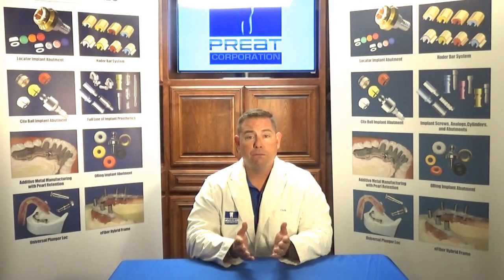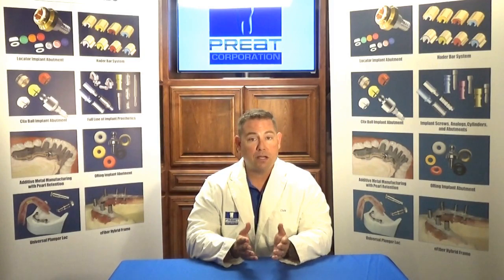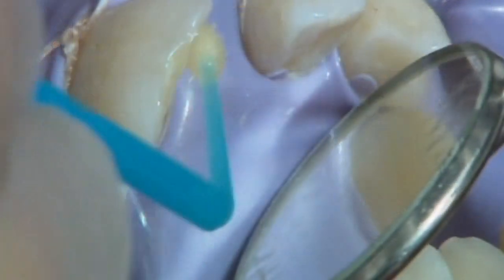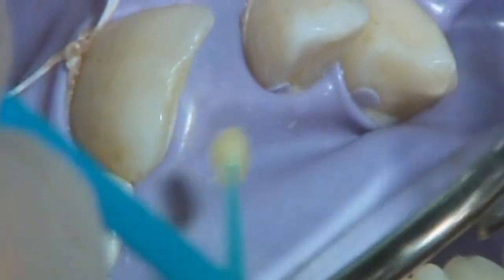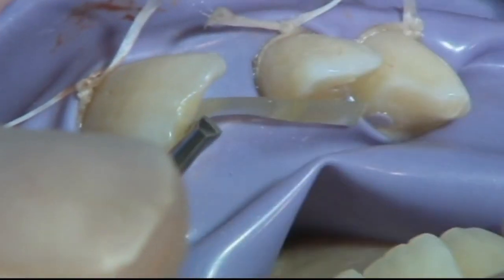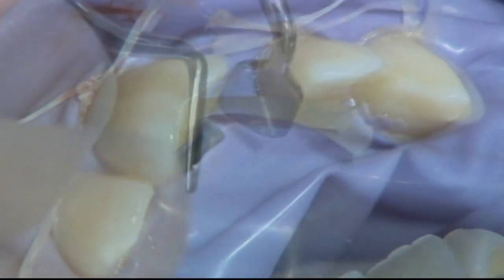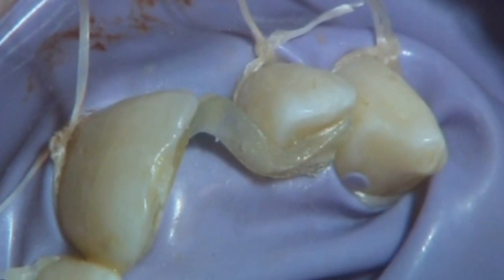How would we do this? If we were doing this in the practice and it was a patient at four o'clock on Friday afternoon who had a wedding the next day and needed an immediate provisional, we would prepare the adjacent teeth using regular composite bonding techniques. We would place one piece of fiber between those teeth, covering two-thirds of the width of the abutment teeth.